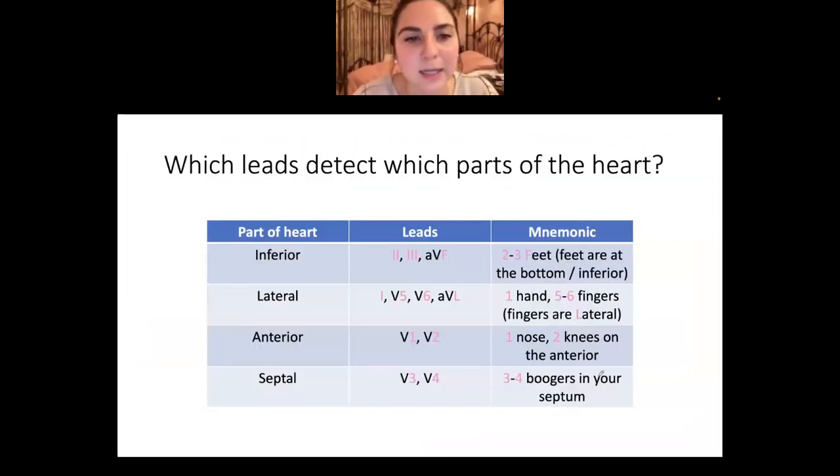And then this is a need to know. I gave you my little mnemonic for how I remember it, and I'll show you. I have some questions at the end that I made up because they can tie these leads into heart dominance or stuff like that. They can bring those concepts back in from first year. So you do need to know inferior leads.